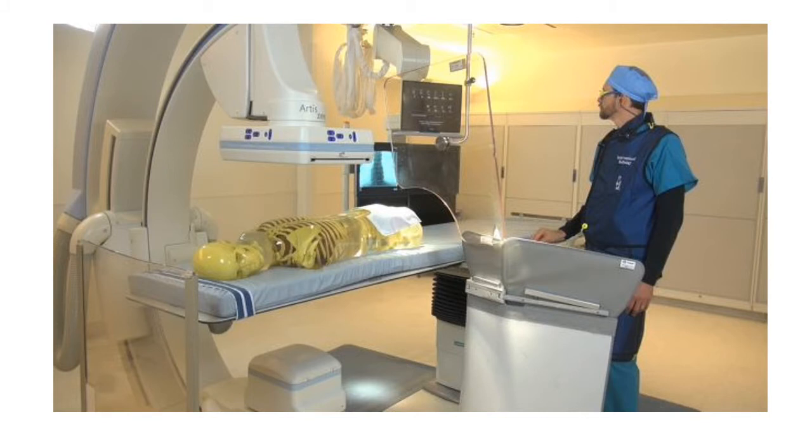Here is a typical cath lab setup. The patient is supine, the operator on the right. Radiation is emitted from below and passes up through the patient, collected by the collecting tube above. It is as if your face is the collecting tube. That is your vantage point as images are obtained.